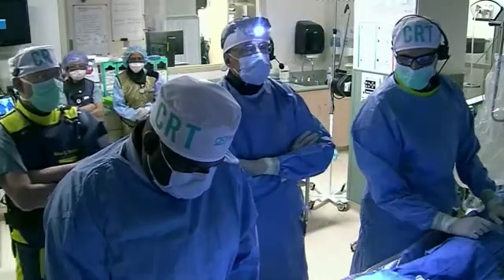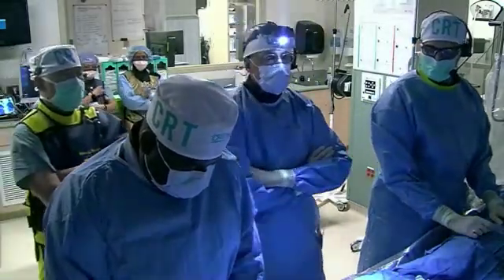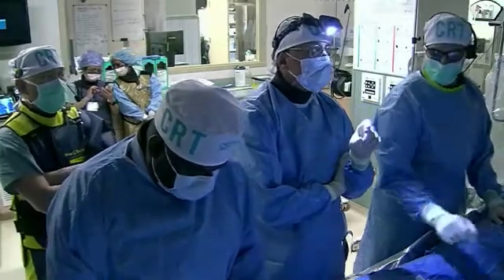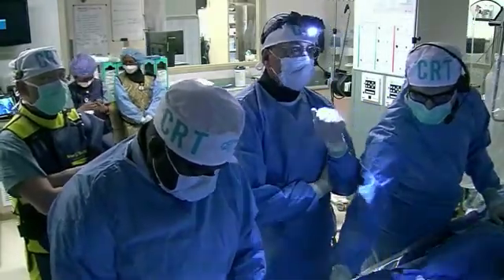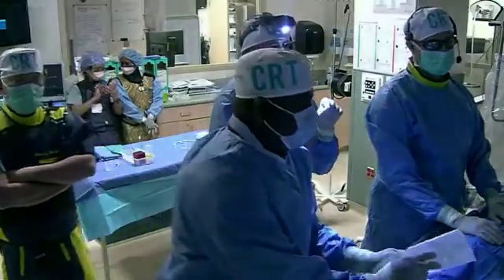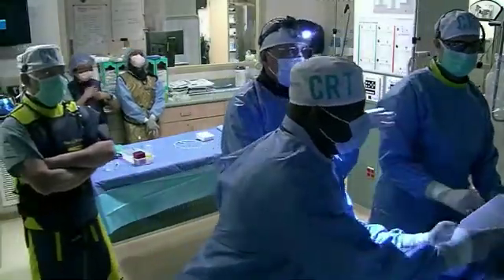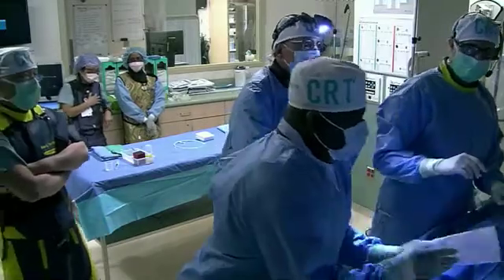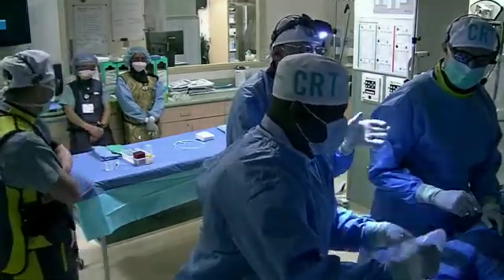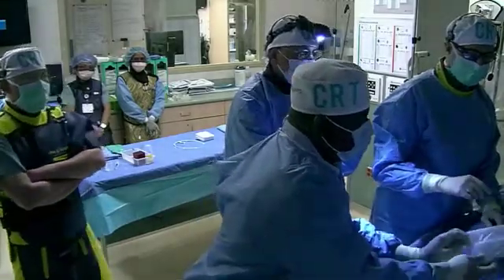Well, there is, Dean. The cost is a problem. Yeah, that's important. I never think cost is important when I see a huge clinical benefit, but the cost is an issue, and we're all going to have this for the next 6 months or longer. So I'm just trying to target best with the information that we have. What would be best in this situation?